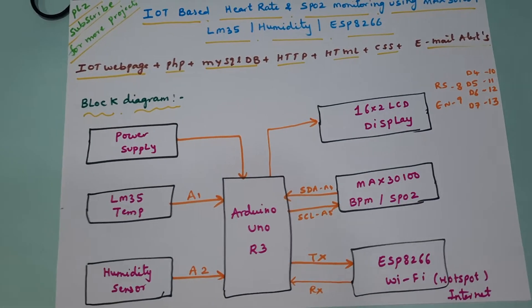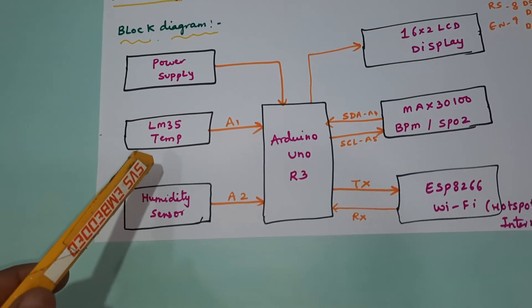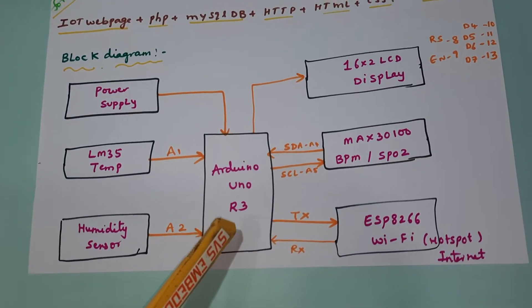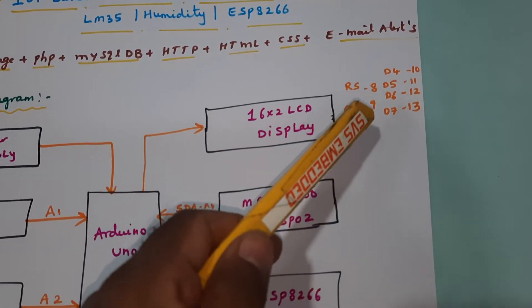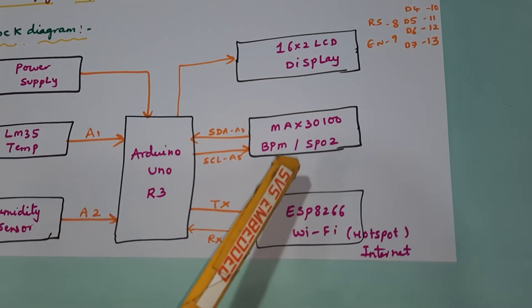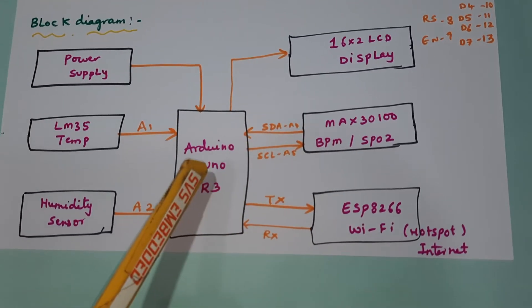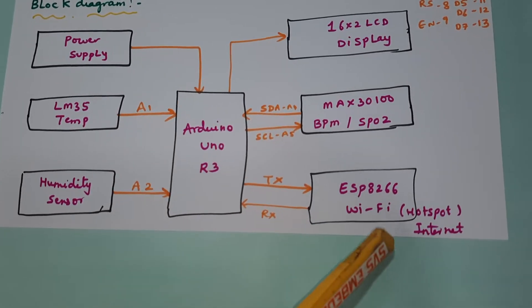We are using a 5-volt power supply module, an LM35 body temperature sensor, a humidity sensor, and the Arduino Uno R3 board. The 16x2 LCD display is connected on pins RS, Enable, D4, D5, D6, D7 — pins 8, 9, 10, 11, 12, 13. The MAX30100 handles BPM and SPO2 via I2C, sending data to Arduino through SDA and SCL.